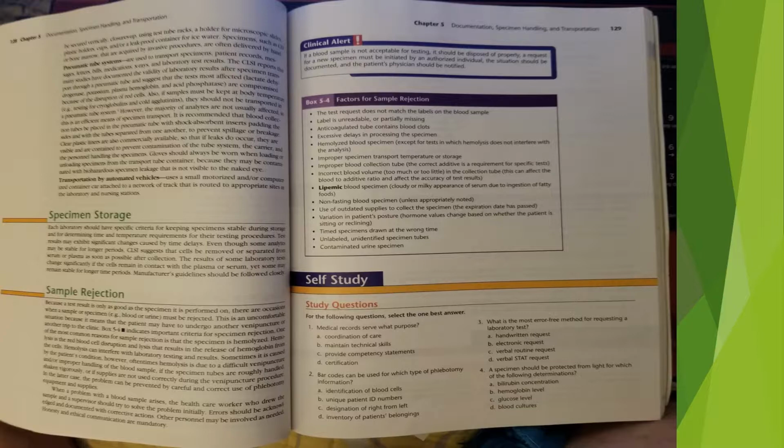Improper blood collection tube, as the correct additive is a requirement for specific tests. Incorrect blood volume, too much or too little in the collection tube. This can affect the blood to additive ratio and affect the accuracy of test results. Lipemic blood specimen, a cloudy or milky appearance of serum due to ingestion of fatty foods. Non-fasting blood specimens, unless appropriately noted. Use of outdated supplies to collect the specimen, when the expiration date has passed. Variation in patient posture, as hormone levels change based on whether the patient is sitting or reclining. Specimen drawn at the wrong time. Unlabeled, unidentified specimen tubes, and contamination of the urine specimen. This concludes Chapter 5.